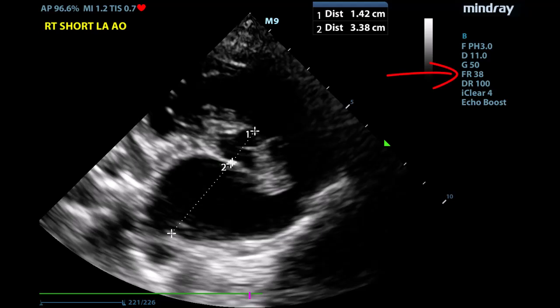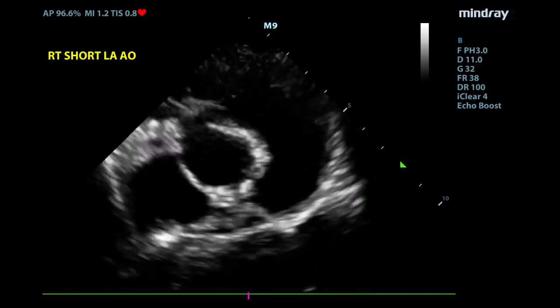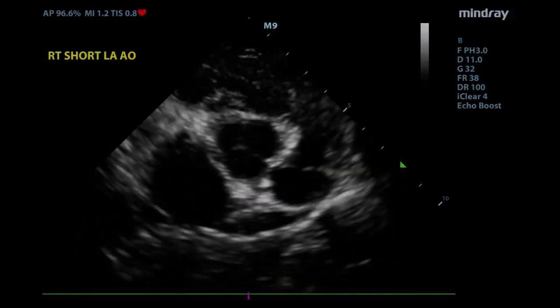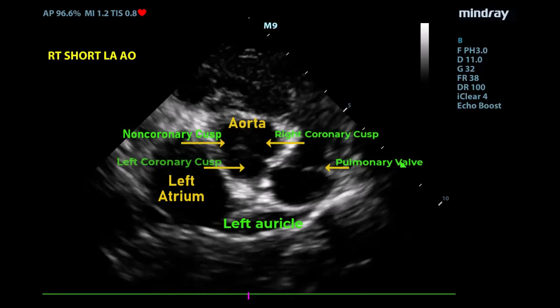Very expensive ultrasound machines, like $350,000, will have multiple motherboards and increased computer capacity to control multiple parameters, resulting in better images and more accurate measurements. Less expensive ultrasound machines, like $30,000 to $60,000, tend to have one motherboard that controls all parameters and has a more limited computer capacity.